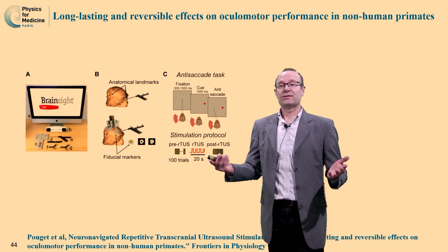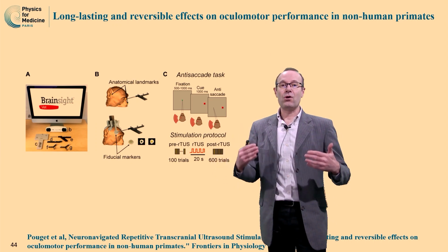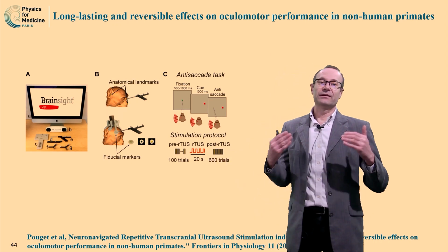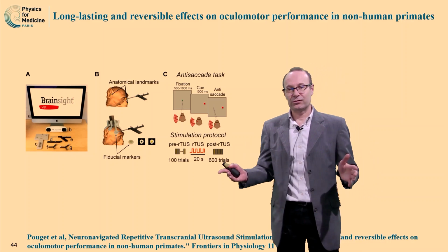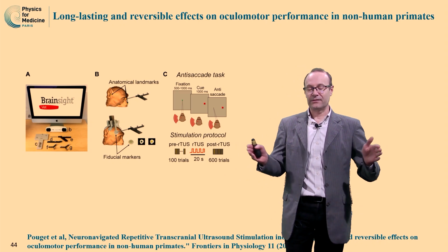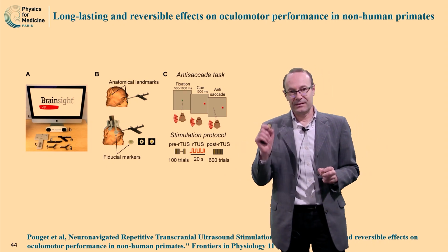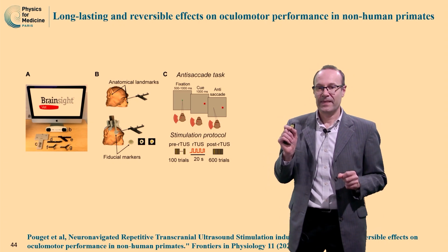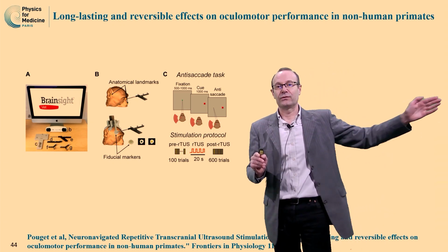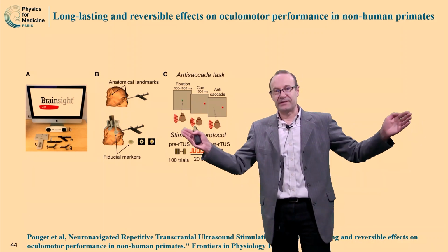One last thing was to be able to induce a long-lasting effect. Here we had an effect only temporarily for a few seconds, but in order to treat patients, we need to be able to induce a long-lasting effect. So instead of sending pulses of ultrasound that were very short, 100 milliseconds, we are using bursts of ultrasound, lasting for 20 seconds.